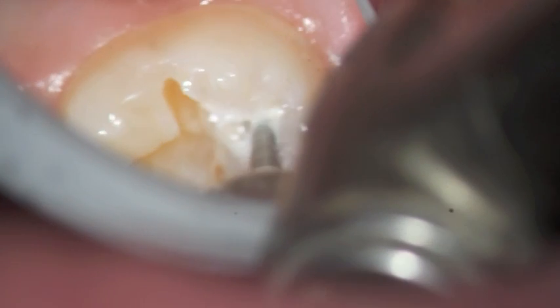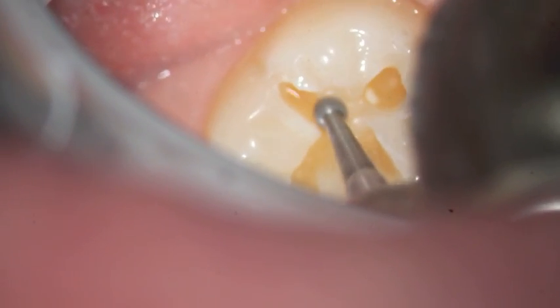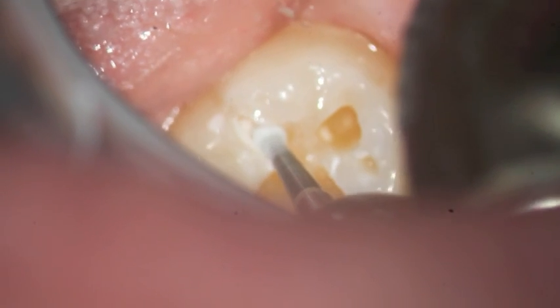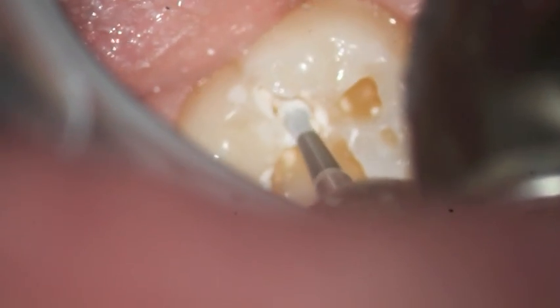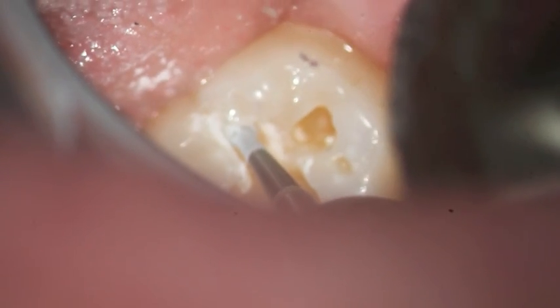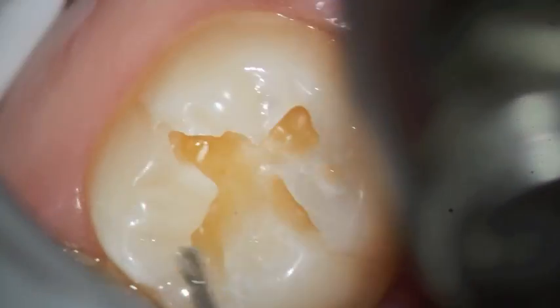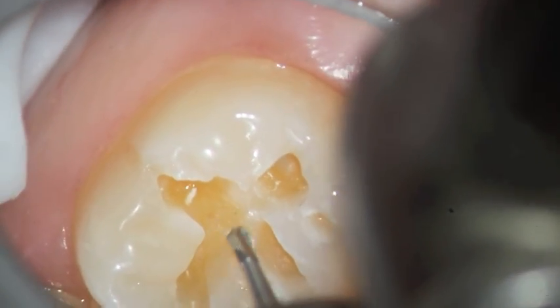And the key is not to use a lot of RPMs on it because we don't want to heat up the tooth. On the other hand, we want to be able to see everything and be sure that we've got the decay out.